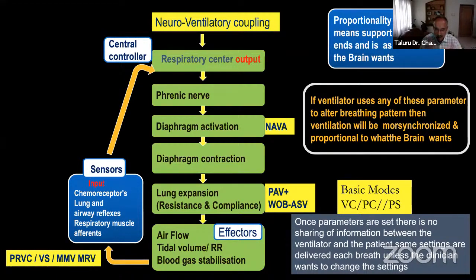But what an anesthesiologist should analyze is all these modes application occurs only when the patient starts interacting, or when patient starts getting up, patient starts weaning, or when the primary pathology is being rectified. As in the operating theater, you don't have to look beyond these three modes. You don't have to move.